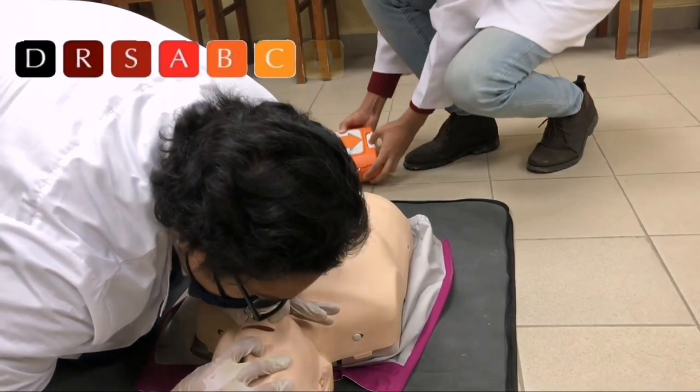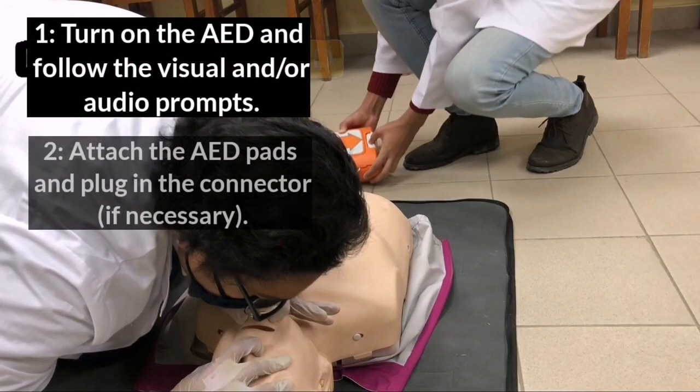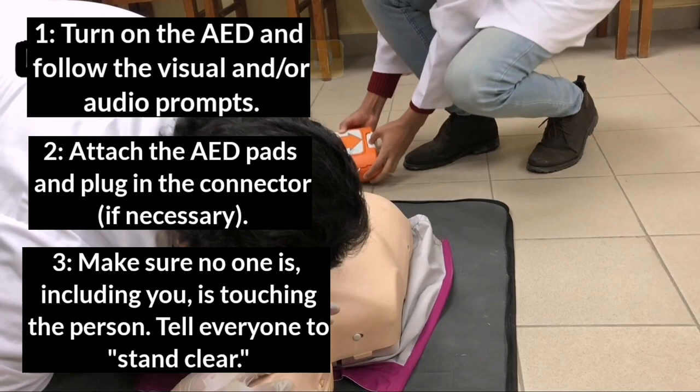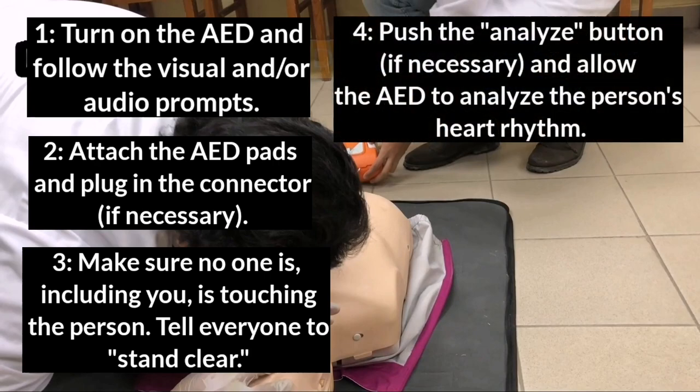Before using it, you must know how to operate the AED. Turn on the AED and follow the visual and audio prompts. Attach the AED pads and plug in the connector if necessary. Make sure no one is touching the person. Tell everyone to stand clear. Push the analyze button and allow the AED to analyze the person's heart rhythm.